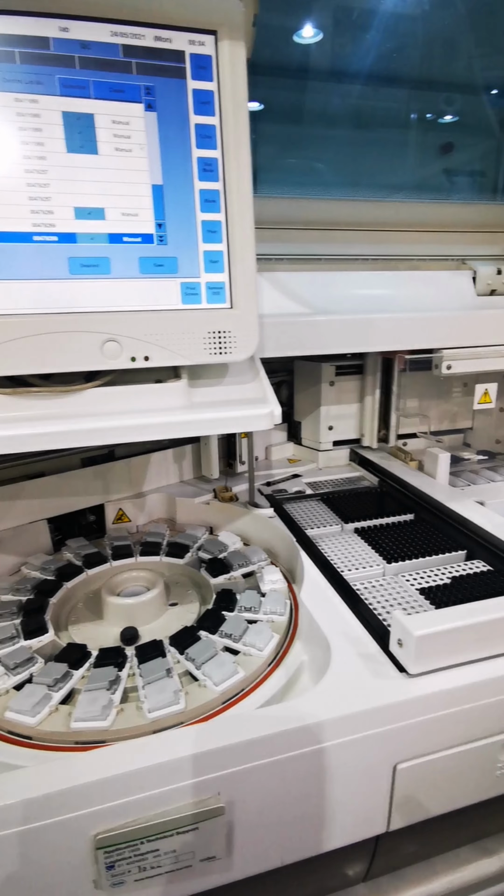And you will see a check mark. Then press save to save the tests that we want to control. Make sure that you select the desired tests. Then press start on the right lower side of the monitor. Then press start once again.